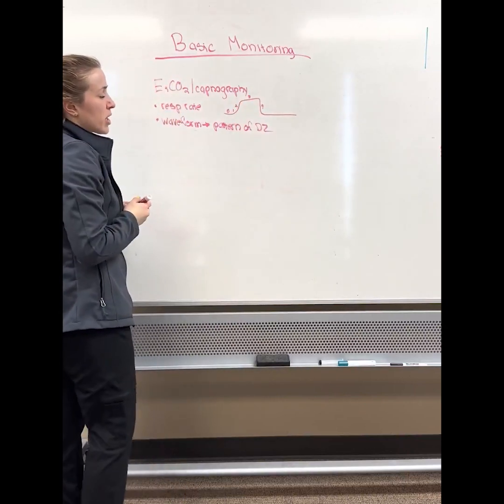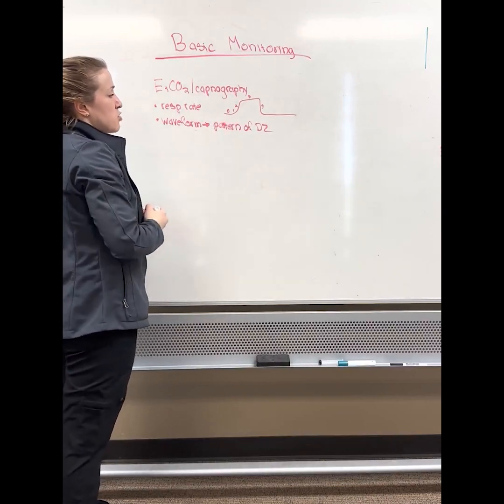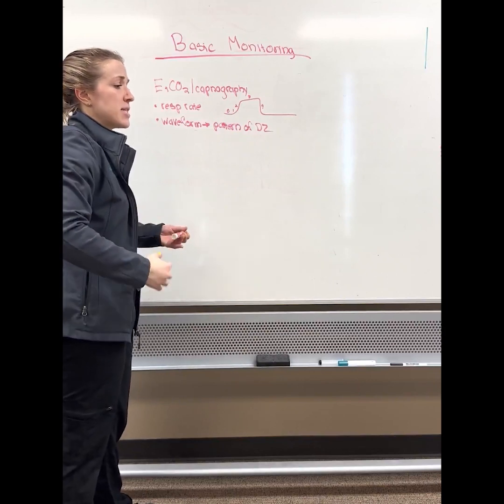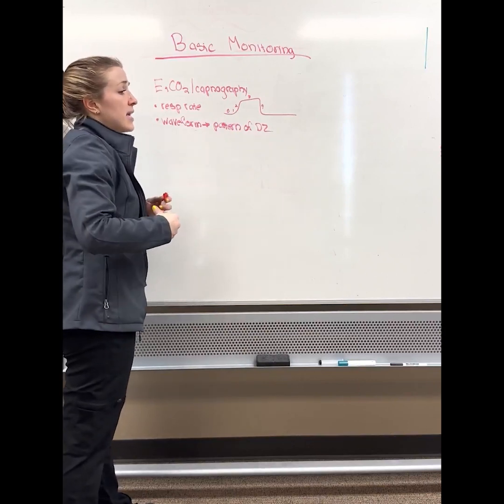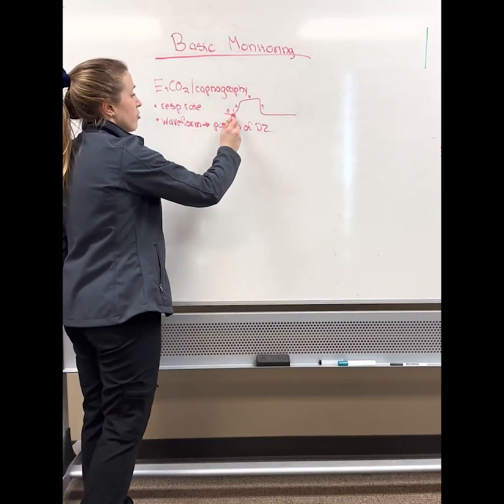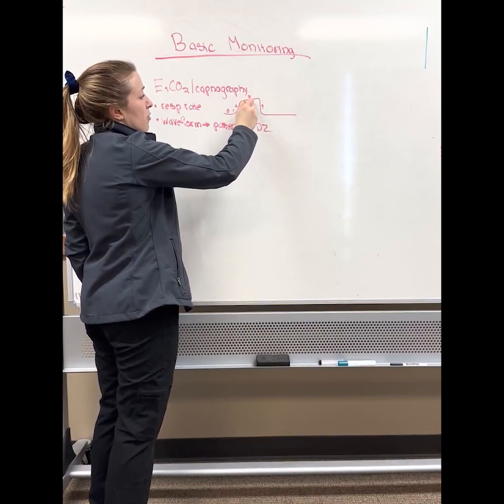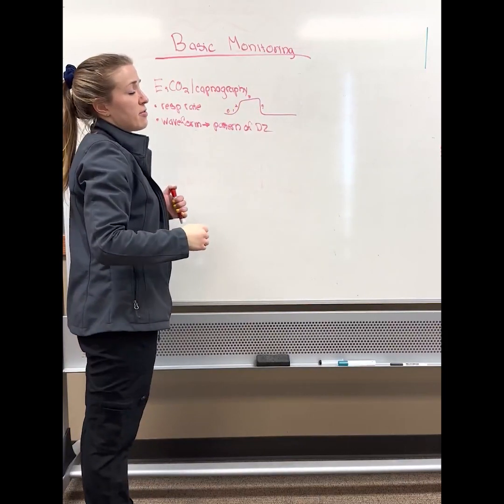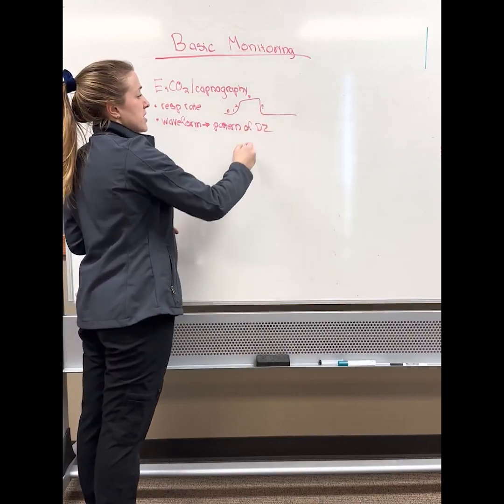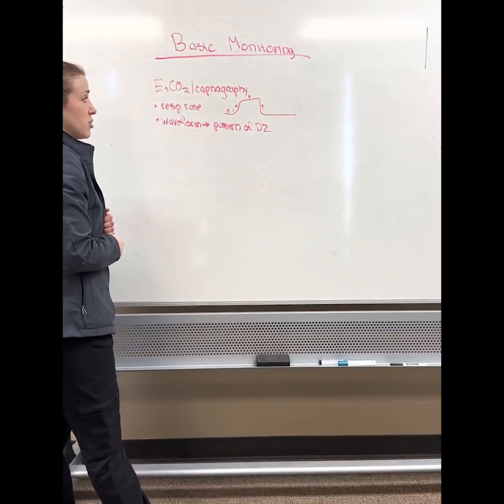Usually measured in 4 kind of different stages. 0 being kind of the baseline, so that's in between breaths. Stage 1 is the beginning of expiration, so as the animal starts to breathe out, the gas being moved by the patient is going to mix with the gas sitting in their endotracheal tube. 2 is a continued climb. 3 is what's called the alveolar plateau. So that is really kind of the emptying of the rest of the alveoli or the lung units. And then 4 is the inspiratory downstroke. So that's when the patient's breathing in again and the CO2 falls back down.